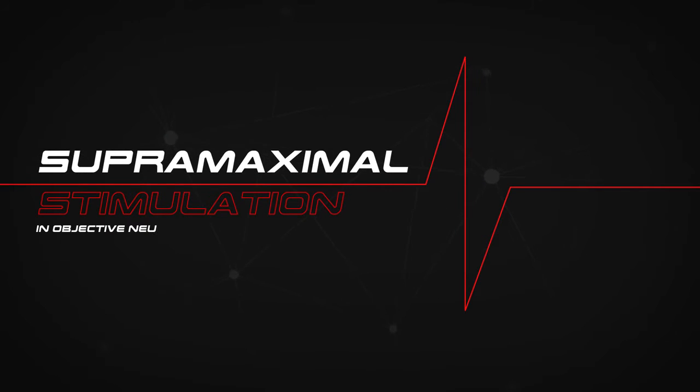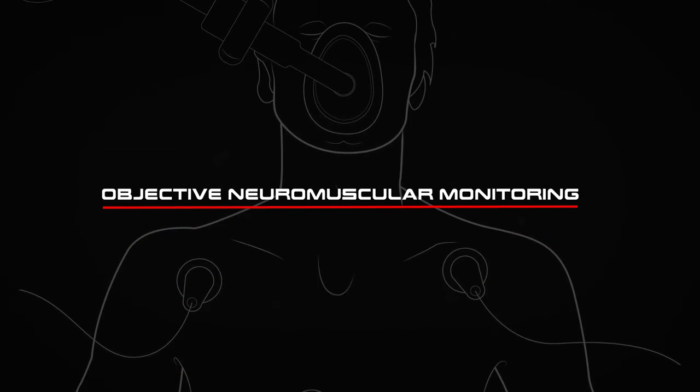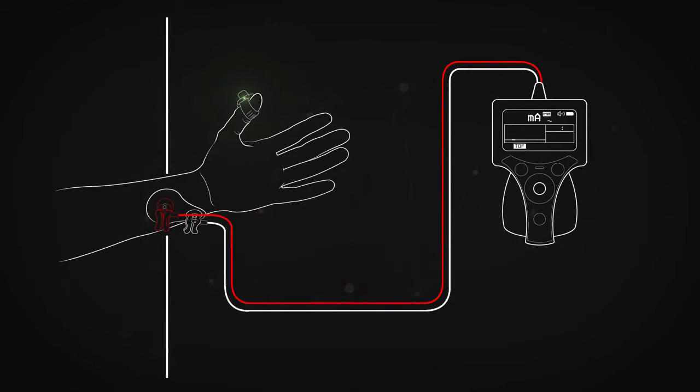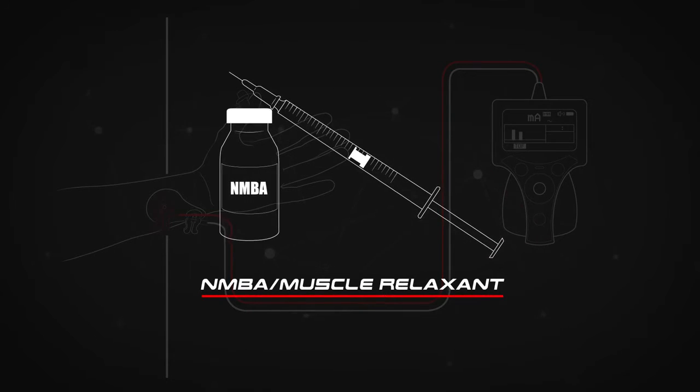Supramaximal stimulation in objective neuromuscular monitoring. Objective neuromuscular monitoring is a process whereby the intensity of a resulting muscle contraction is monitored with an electrical nerve stimulus to determine the efficiency of a neuromuscular blocking agent, or NMBA.